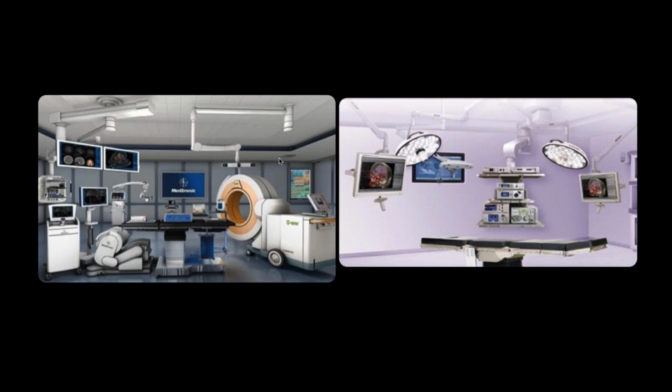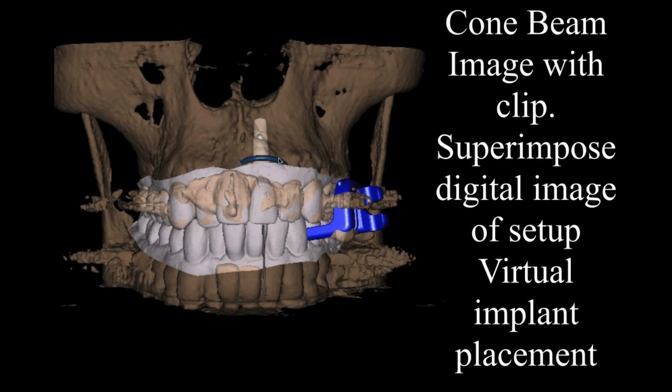I had a pop-up. So now what we want to do is something like this. What you see in front of you, in the brown, is a three-dimensional view of a cone beam CT scan. But in the white, you see the intraoral scan of the patient, which is an STL file. That's .stl, like .mov, .mp4, .doc. This is .stl. It's a three-dimensional image. And you can see it's been superimposed on the CAT scan. And then you can see an implant positioned right here. You can see that implant up there. So that's what we're doing.